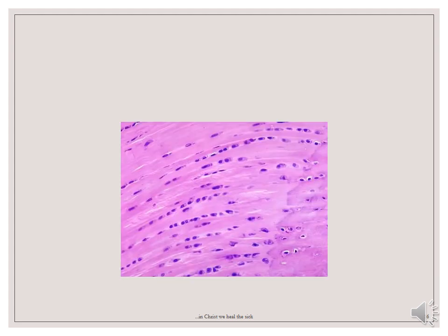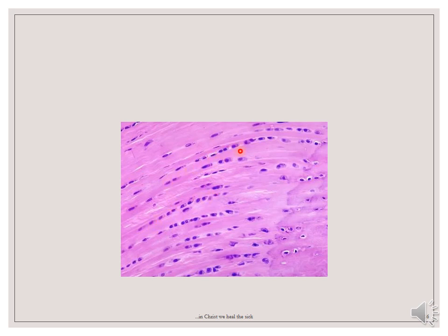This is a fibrocartilage. The fibrocartilage has features intermediate between cartilage and dense regular connective tissue. In addition to type 2 collagen seen in the matrix of cartilages, fibrocartilage also possesses type 1 collagen in its matrix. These thick bundles of collagen fibers in the matrix are arranged in a regular manner, as you can see here — unlike other cartilages. The chondrocytes are located in their lacunae, arranged between these collagen fibers in single or narrow rows.